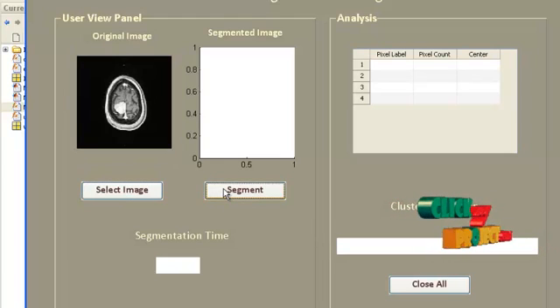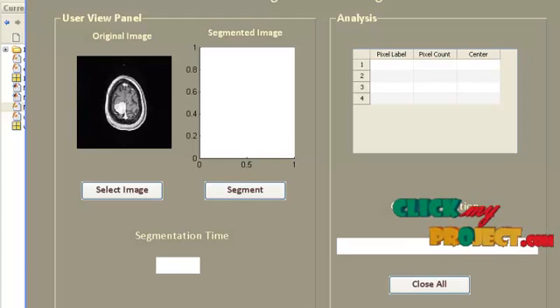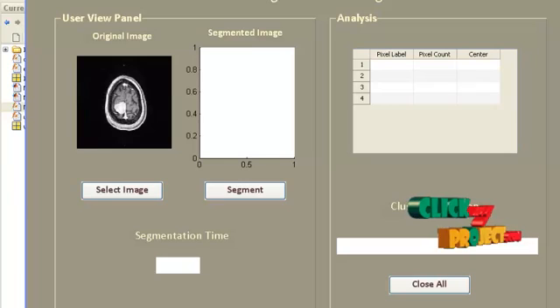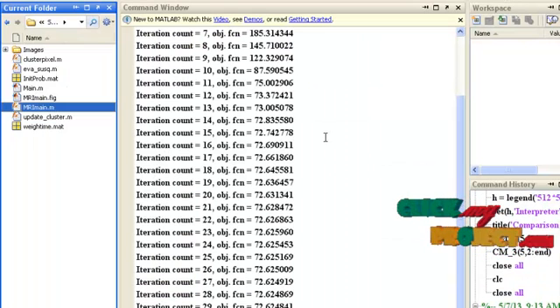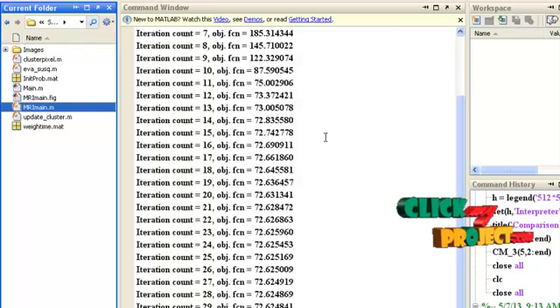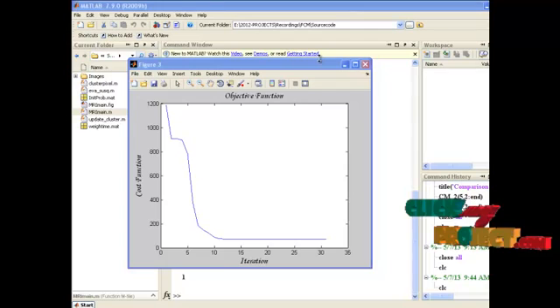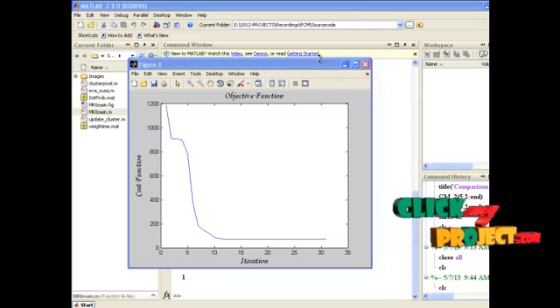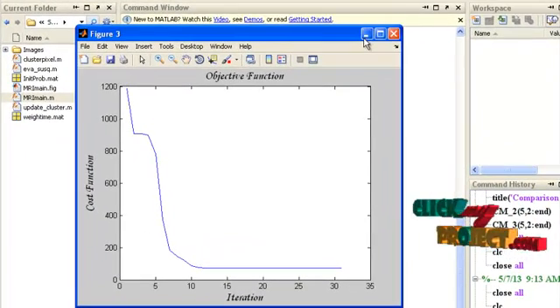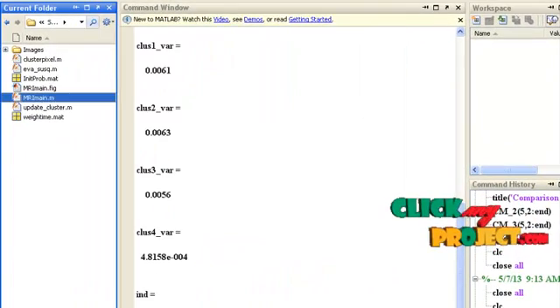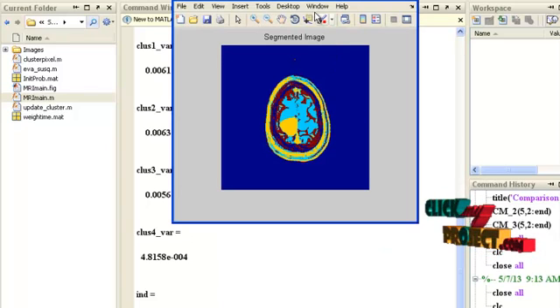The selected image will be displayed. Then press the button 'Segment'. In the command window the iterations will be running and displayed. For each and every iteration, the corresponding objective function value is also displayed. Let us see the intermediate results — the first is the objective function, showing cost function versus iteration.